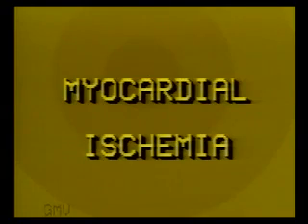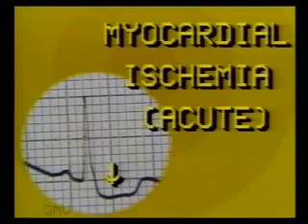Myocardial ischemia. Acute myocardial ischemia. For this, we will consider a patient with atherosclerotic narrowing of the coronary vessels. He is comfortable at rest, but on exercise gets anginal pain.